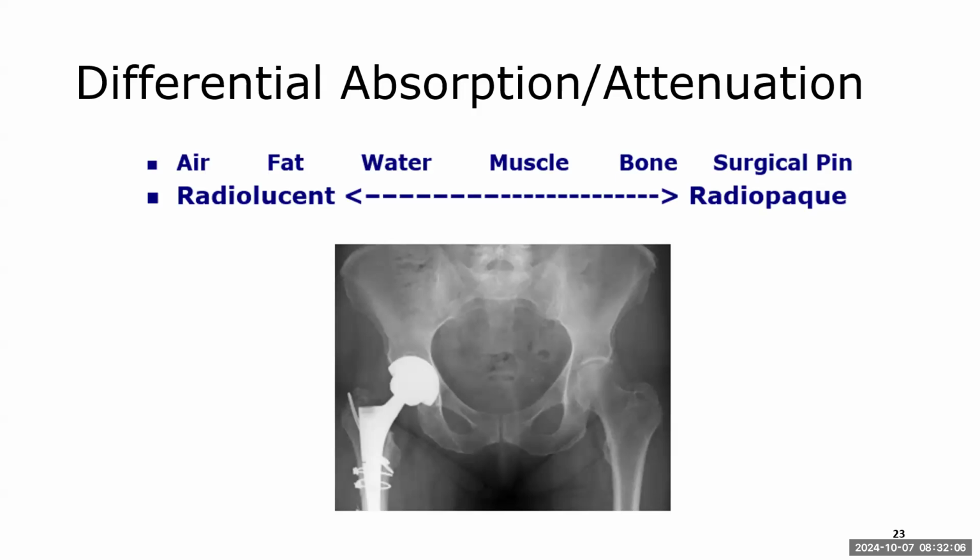So on this image right here, you can see it starts with air on the left and moves through, showing how the brightness levels would change based upon that particular part. Air is going to produce very dark brightness levels, right?